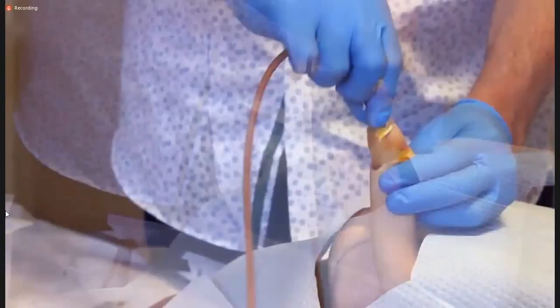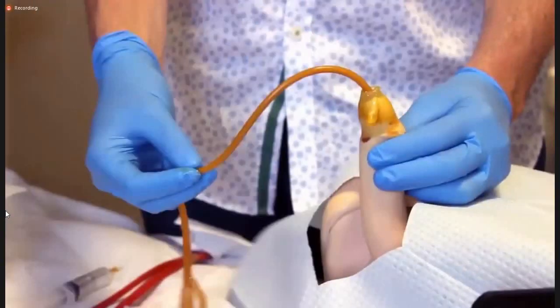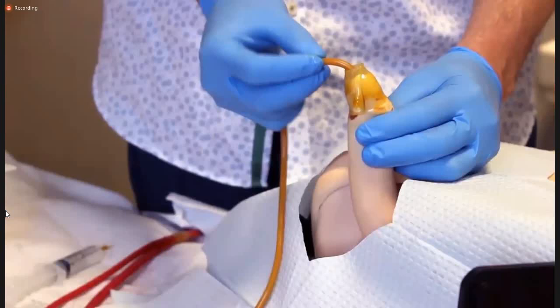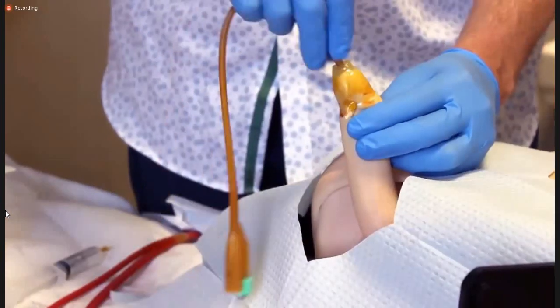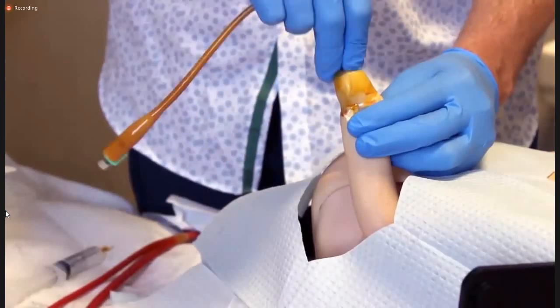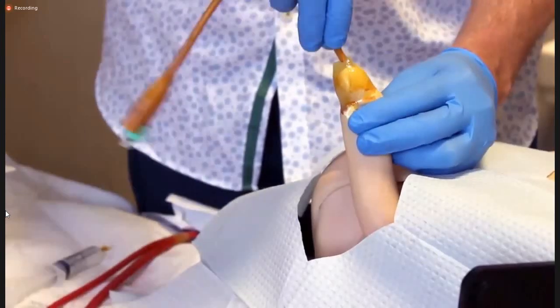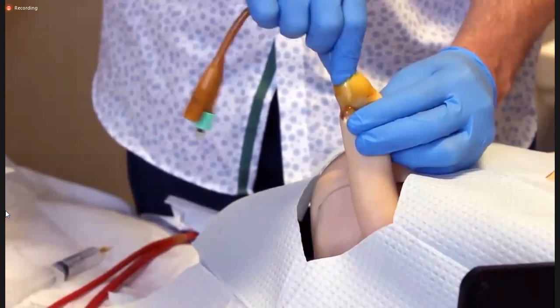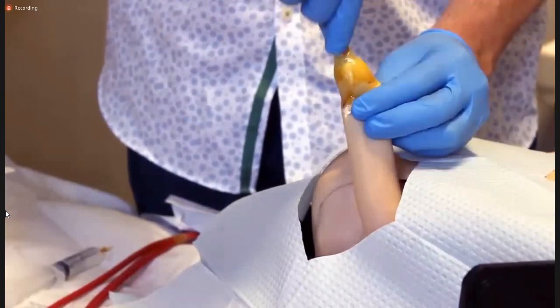And then the key thing is not to grab halfway down the catheter. You want to very firmly, with very short sections, advance the catheter into the urethra, very gently. So about 1 centimeter or 2 at a time, steady pressure. If you grab too far back, it's going to buckle, and you won't be able to get the catheter in. So a firm but steady pressure, 1 to 2 centimeters at a time, passing the catheter in through the urethral meatus with the penis on stretch throughout.